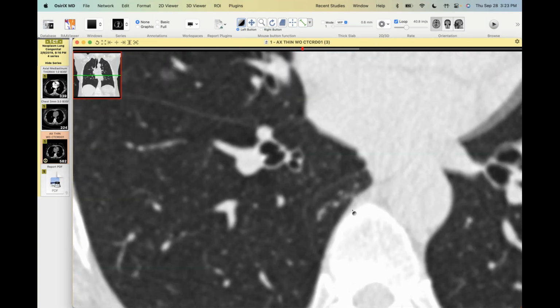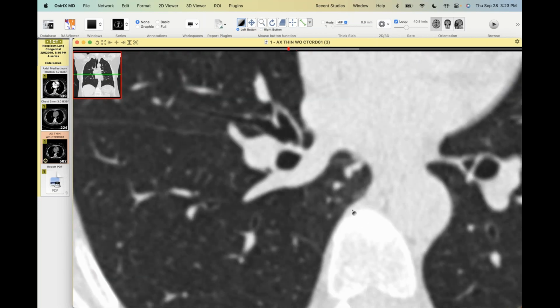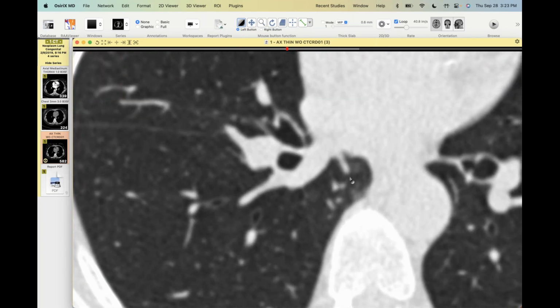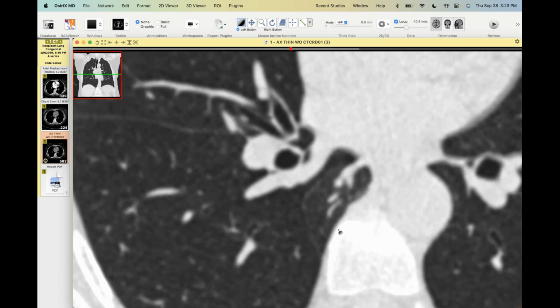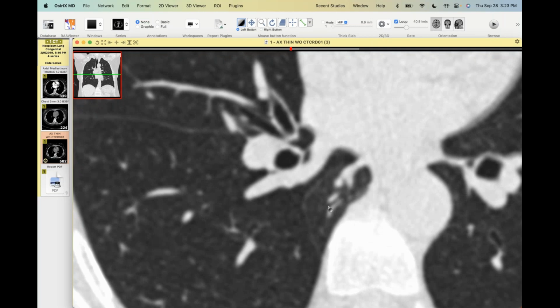And then the venous drainage is supposed to be systemic, but this one's being aerated, so it must have some connection with lung tissue to keep it aerated, right, if it doesn't have a good bronchus. So I think it's kind of a hybrid, intralobar, extralobar. Well, I think that's good. I think this is a great case, but it's unique in my experience at least.